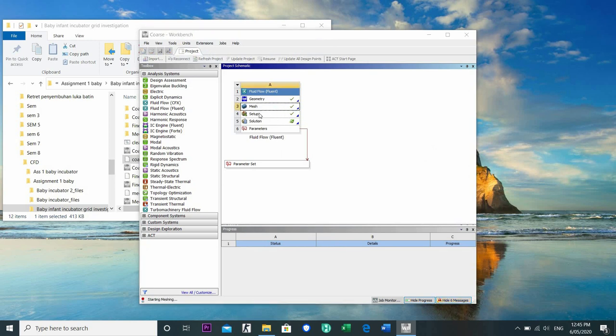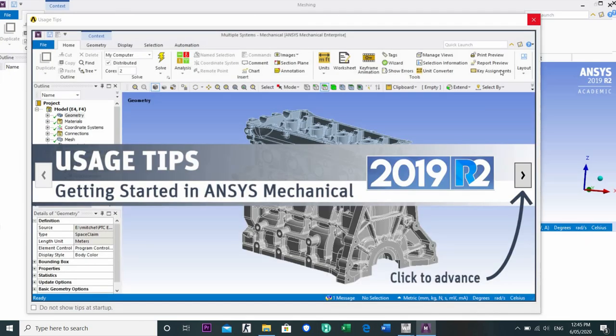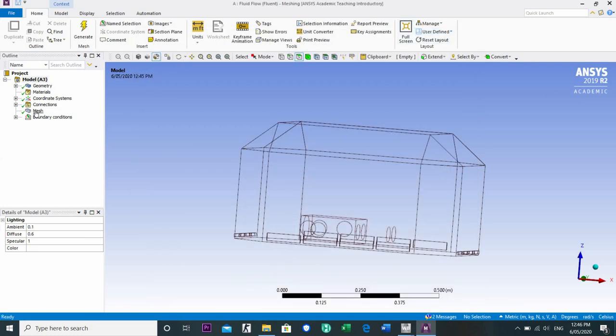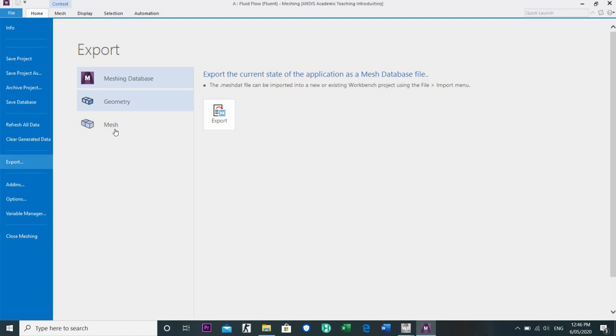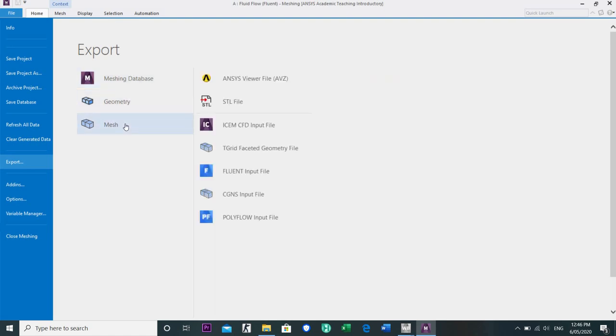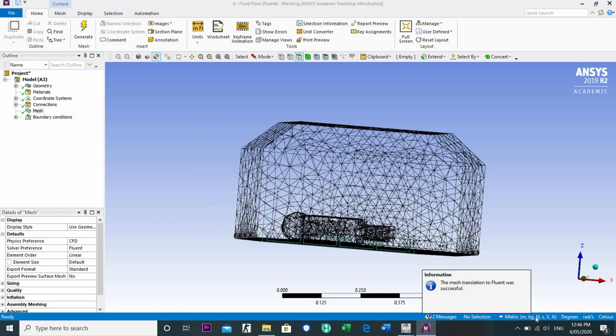Okay, as we can see here, because at the time the setup is not working really well, I do the mesh export and then I import again. I don't know why there is an error like that on my computer. Okay, as you can see here, this is the meshing side, and then we can go to the file and then export. It's in here, not meshing database, not geometry, it's a mesh. And then the mesh, we are going to Fluent input, and then it's going to be .msh, and then we are going to say export and then go to the coarse or, for example, 2, and then you need to save like this for example, and then the mesh translation to Fluent was successful, and then we can close this one.